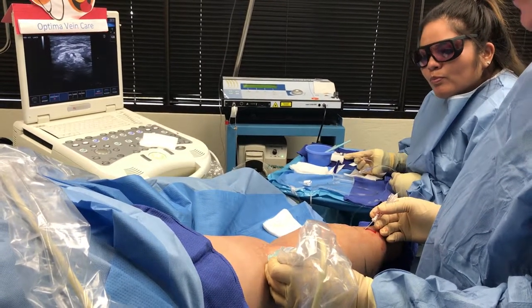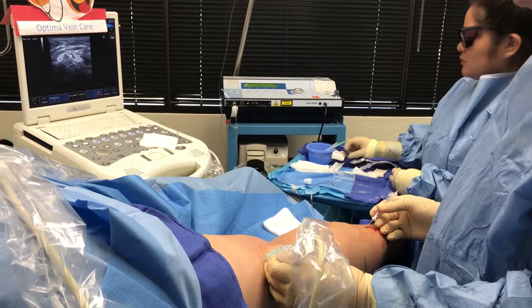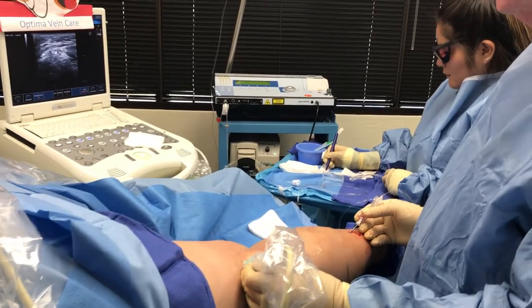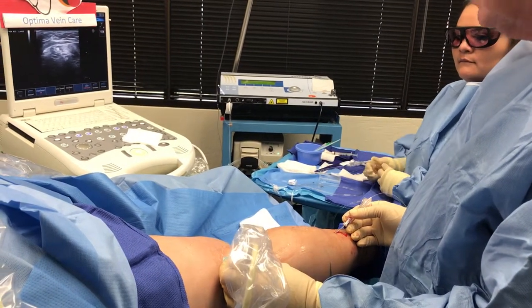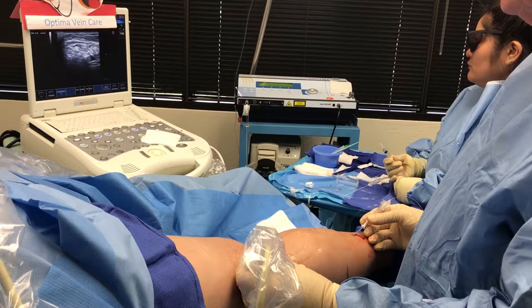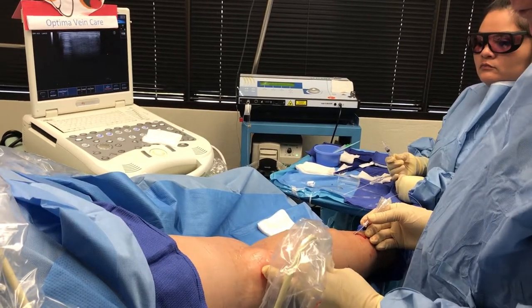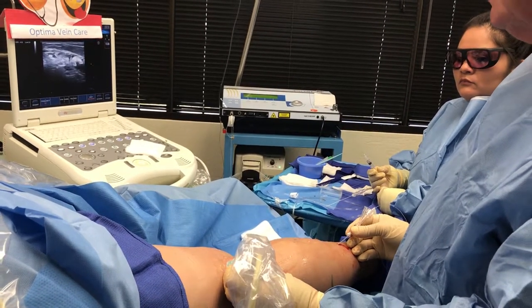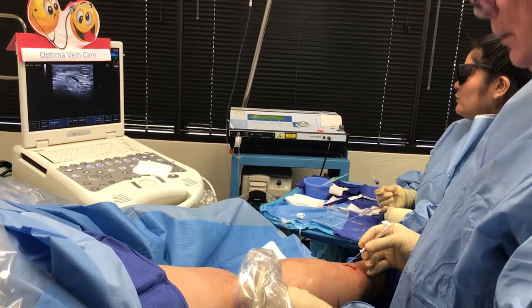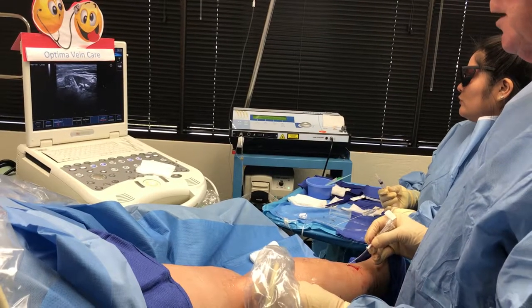Let me know if you feel any pain. I like to give about 100 joules right at the top to put a kind of a lid on the top of the vein. We're starting to pull it back. I like to give about 50 joules per centimeter of vein, and in the literature it reliably closes the vein.